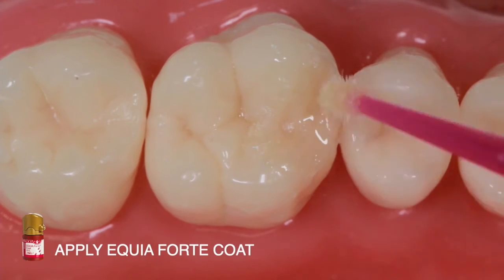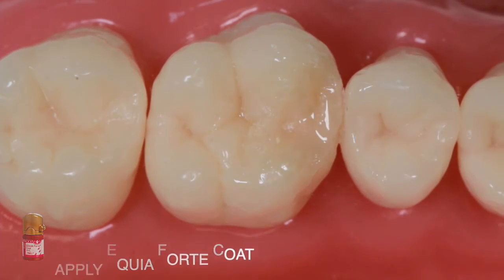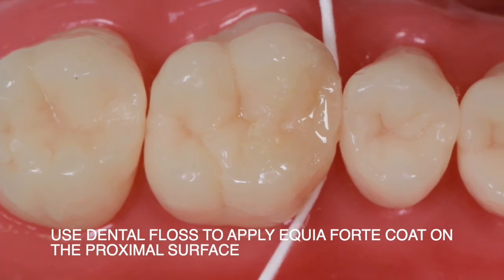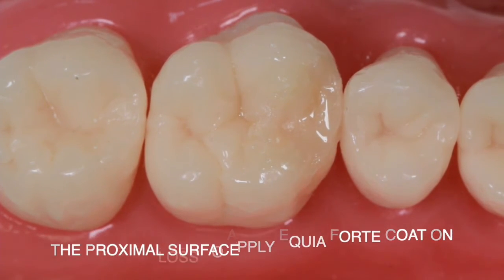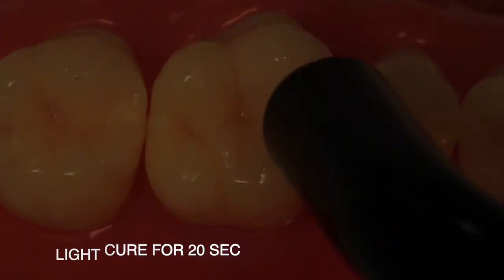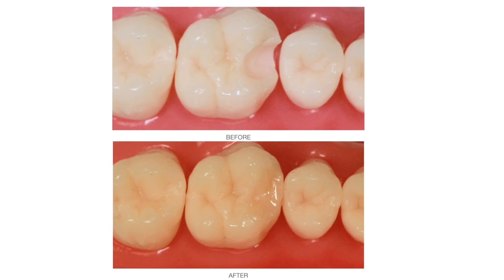Next, apply the Equia Forte coat. Use dental floss to apply Equia Forte coat on the proximal surface. Then light cure for 20 seconds.